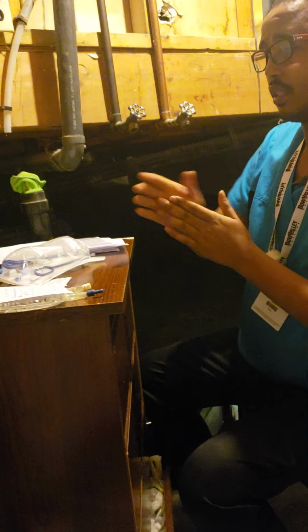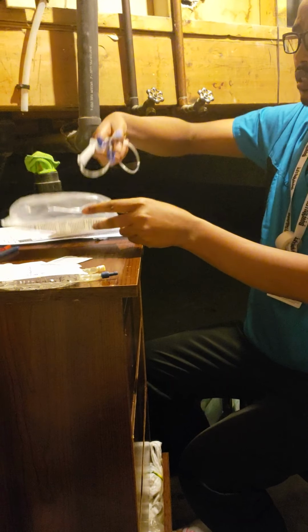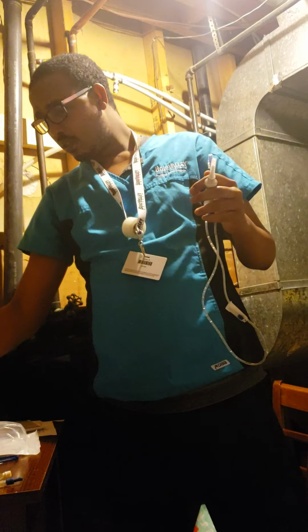The next step is I have to open my secondary line. Open it and then hold the tip. It is usually open, so I have to close it and then connect it to my primary tube.